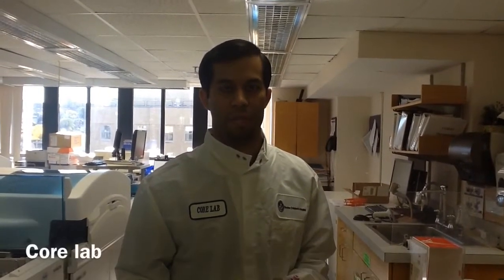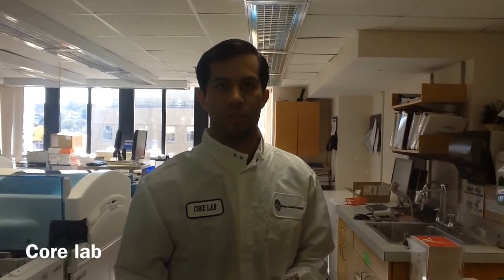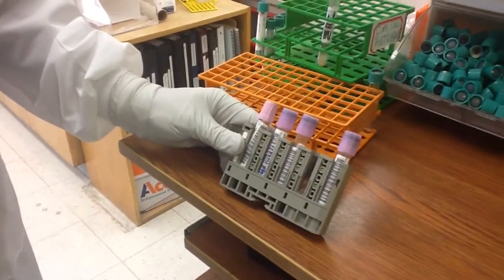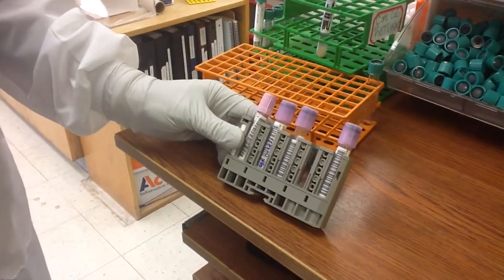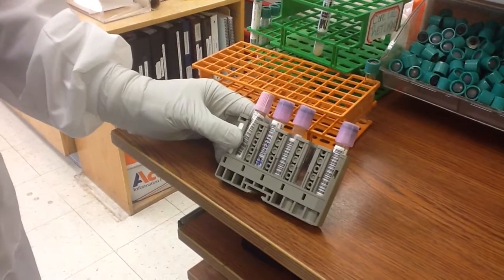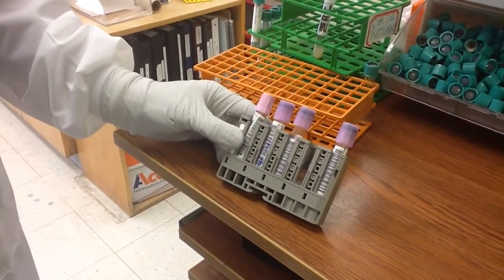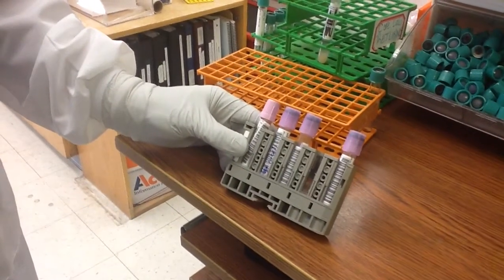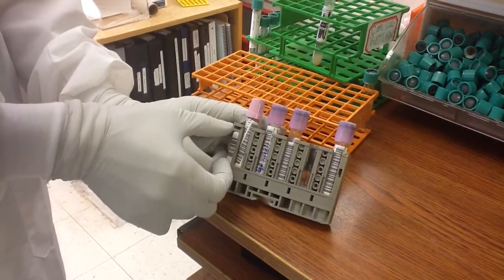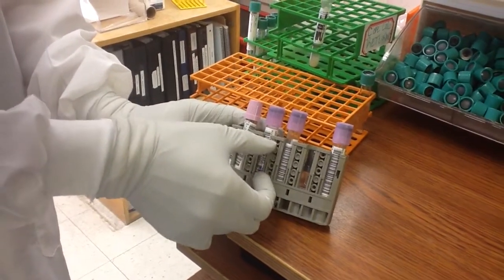Now we're in core lab and the samples have finished processing in lab control. This is where mislabeling issues create turnaround time problems and workflow issues. Samples are placed in a rack and then onto the instrument. These barcodes contain information about which patient belongs to which tube and what test is to be run. When the barcode reader scans each rack, it is only reading in the middle area of the rack.